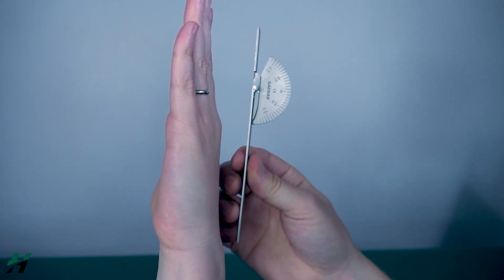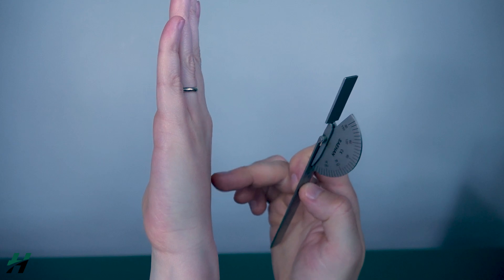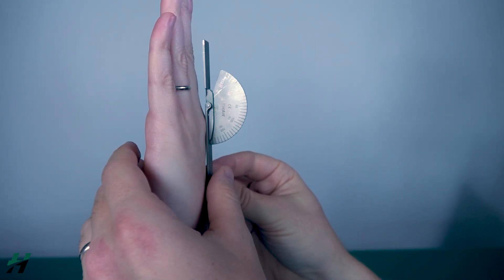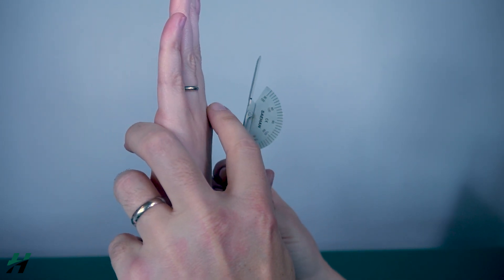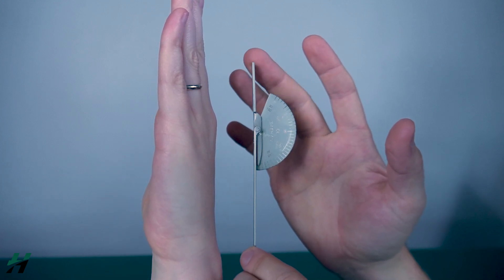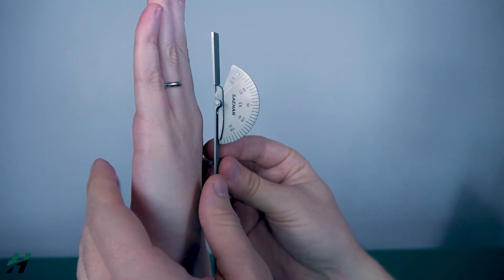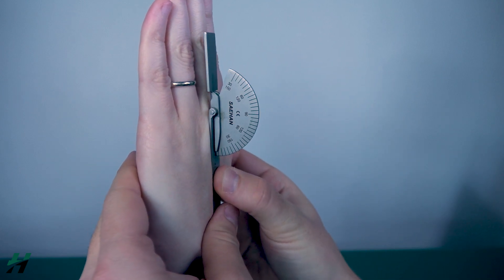Measuring MCP flexion: you want your patient in a seated position with their elbow on the table. Grab the stationary arm of your goniometer and put it on the desired metacarpal — in this case we are doing the third digit, so on the third metacarpal. The axis is on the MCP joint, and the movement arm will be on the proximal phalanx.